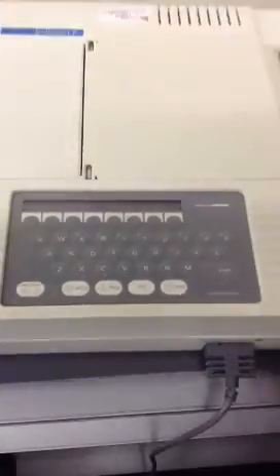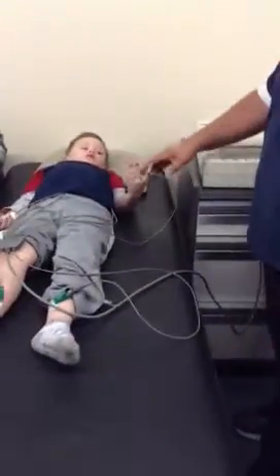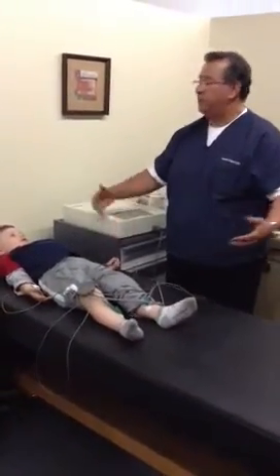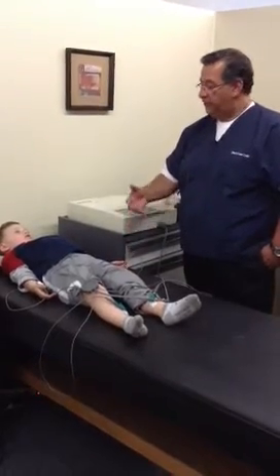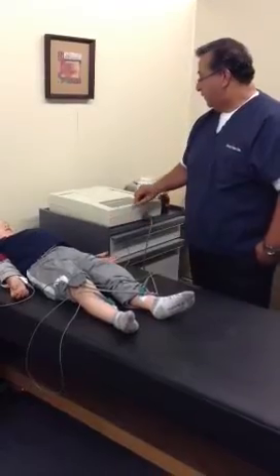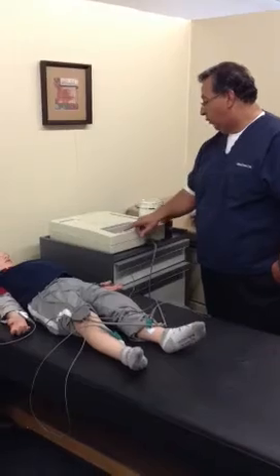Now before we begin, we're going to turn back to the patient and have the patient relax as much as possible. We need you to relax as much as possible. What I really want you to do is lay your hands flat — don't move. Lay your hands flat by your side. Relax your arms and your hands, your legs and your feet, like you're asleep. If you see that your patient is moving, this is not going to work. So you need to relax — no moving. As soon as the patient looks relaxed, we're going to go ahead and hit the auto button.